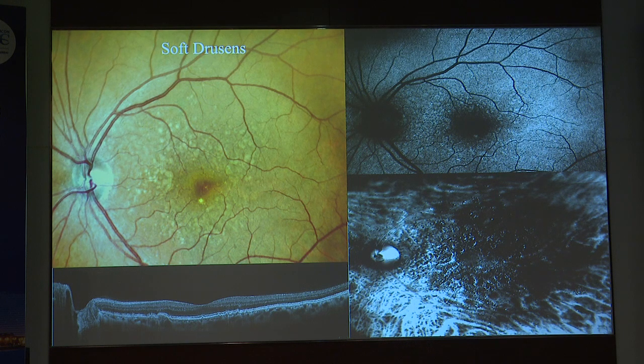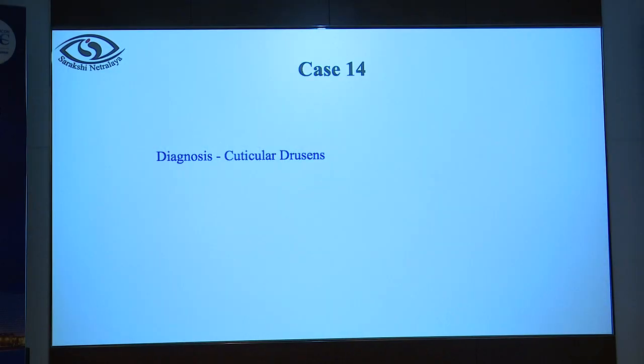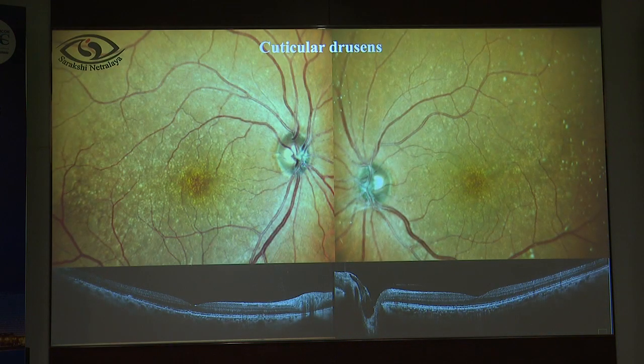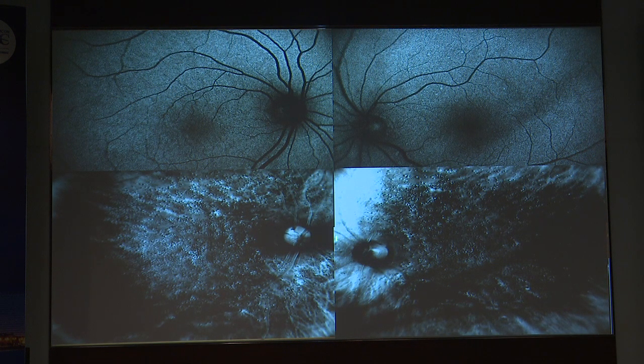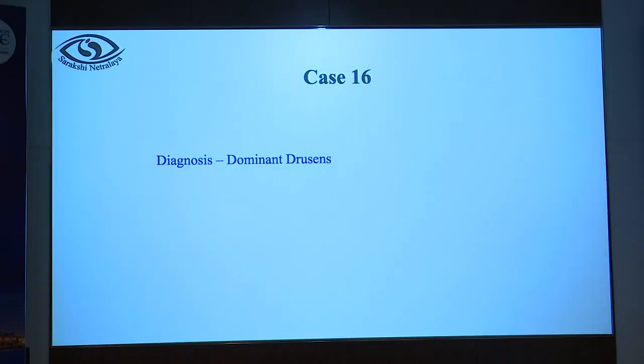Can you visualize and understand that? That is the beauty of this system. Now look at cuticular drusen. Here is a drusen, now look at the extent of involvement. This is quite a significant one. Now they are trying to develop counters by which they can actually calculate the number of RPE cells which are involved. And this will help us in better prognosticating.